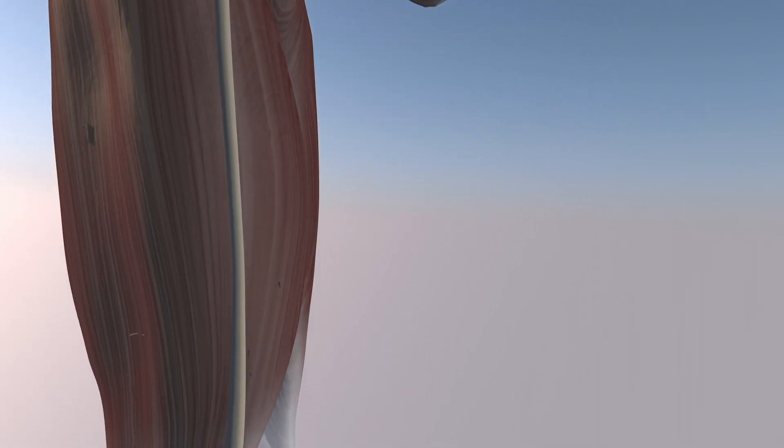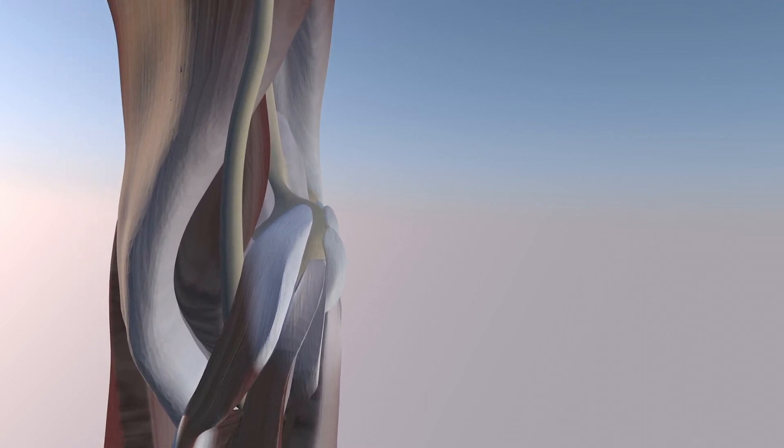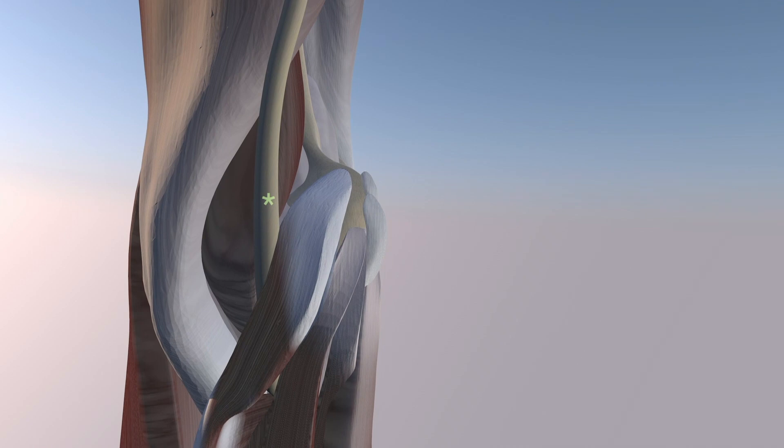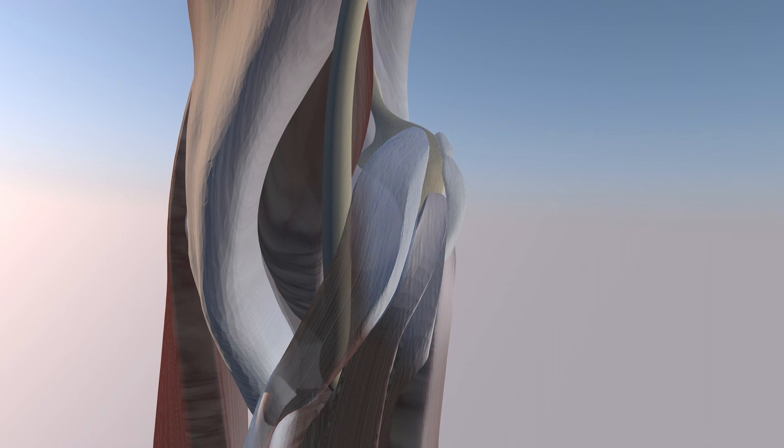Now we're just going to go distal. You can see how it tracks medial to the short head of the biceps muscle. Here again you can see the median nerve — it is under the humeral head of the pronator teres muscle, and it also tracks between the humeral and ulnar head of the pronator teres muscle.